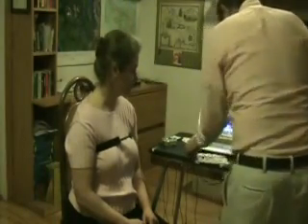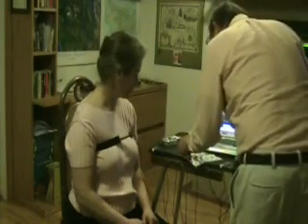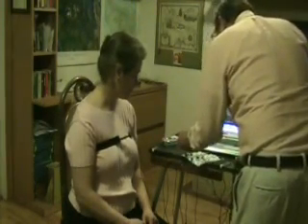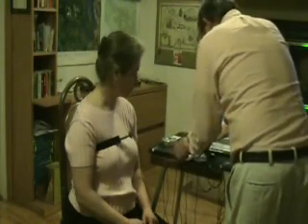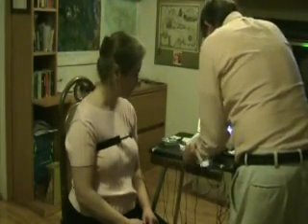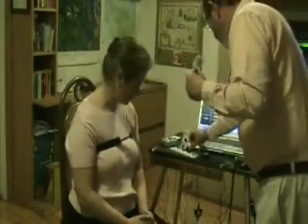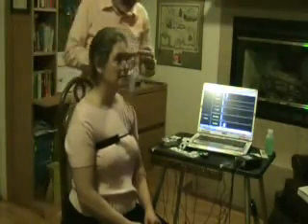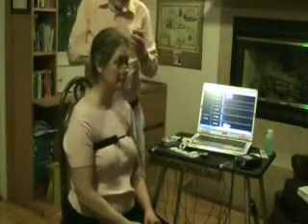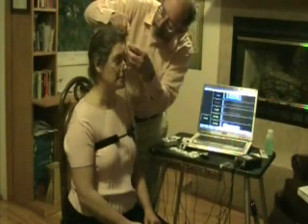I'm putting the sensors and sensor leads together on a table so that I don't have to press against you, because it would be uncomfortable for you when we do that. So this set is going to go on your forehead. And I'm going to put a little piece of tape on the chair behind you so that these sensors don't annoy you, so they're not hanging down over your eyes. You don't have to have your eyes closed if you don't want them there.